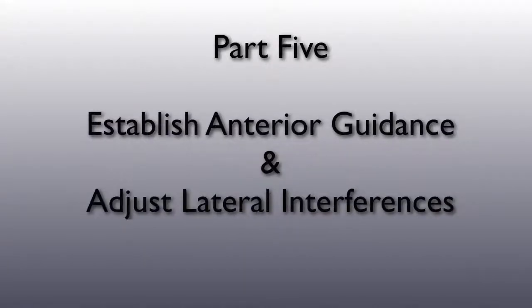Part 5 of this video series is on adjusting anterior guidance and eliminating lateral interferences. After that is accomplished, then we recommend doing exactly what Dr. Wilson did on the maxillary orthotic. Have the patient close in back and grind hard in little bitty circles and adjust those posterior fossae until the last trace of detrusion has been eliminated.